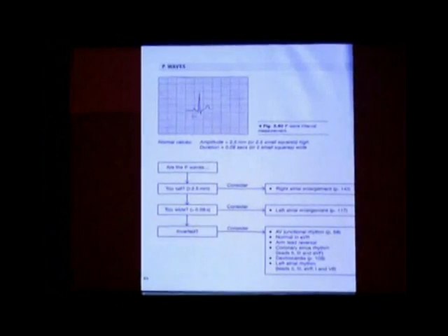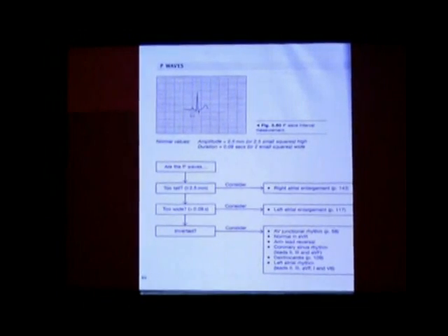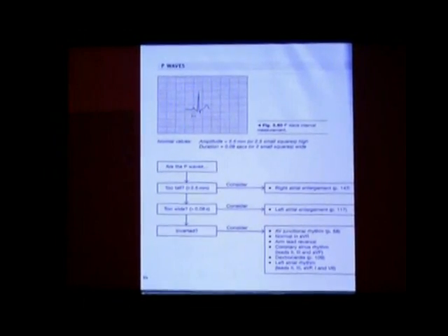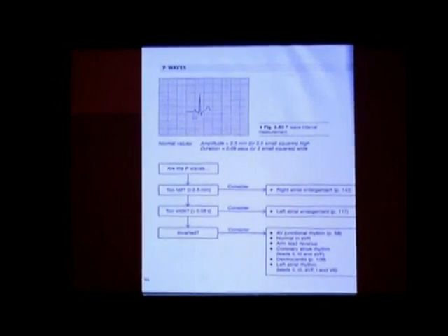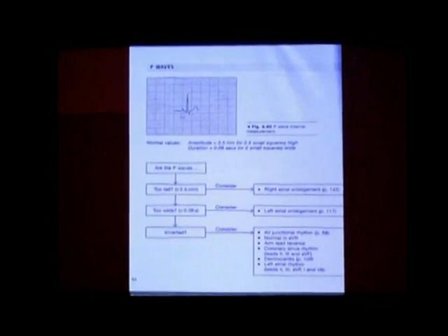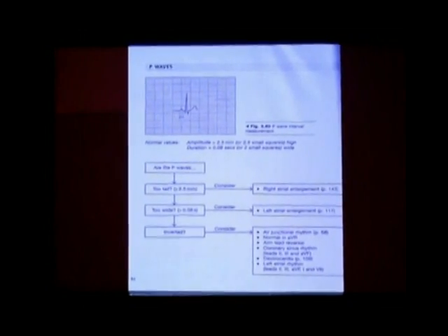Before you read an ECG, you must make sure of the patient's name, sex, age, and also the standardization and the speed, and make sure the ECG belongs to that particular patient. Many times the ECG you see may not belong to that particular patient, so you may be treating some other disease for some other patient. So all these things happen.